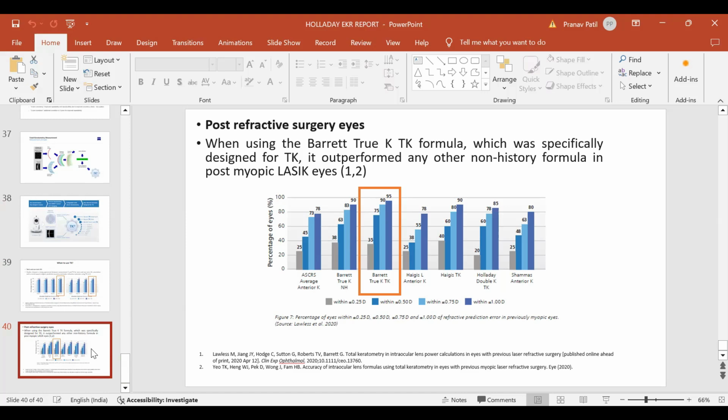But I think we did cover a lot of very important aspects today. Thank you for working hard to make it meaningful and fruitful, because a lot goes into preparing these classes. I think we all have a better understanding of where to use which K readings, and also the EKR report, EKR 65, and how it is centered, and the total corneal powers, because these are very important concepts to understand. And if anybody has any questions, it'll be nice.